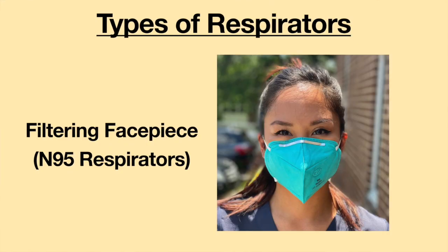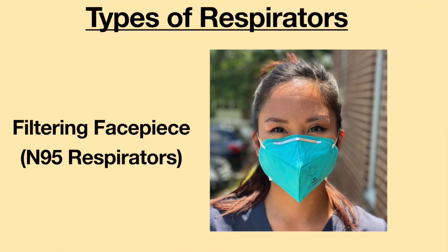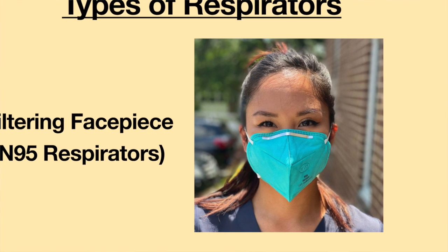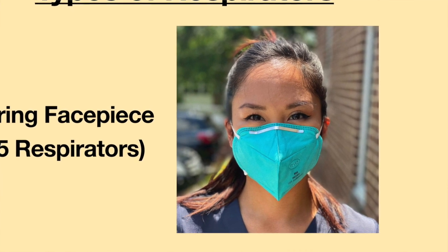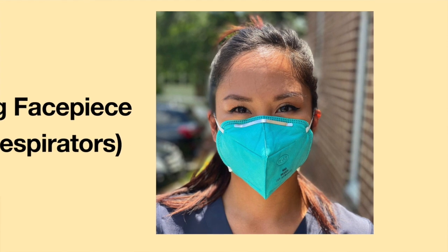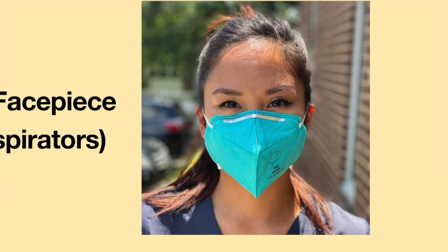The four most common types of respirators include filtering face piece respirators. N95 respirators are a filtering face mask respirator, commonly used in the medical profession. These disposable masks cover the nose and mouth and can filter out particles such as dust, fumes, and mists. They do not protect against gas or vapor.